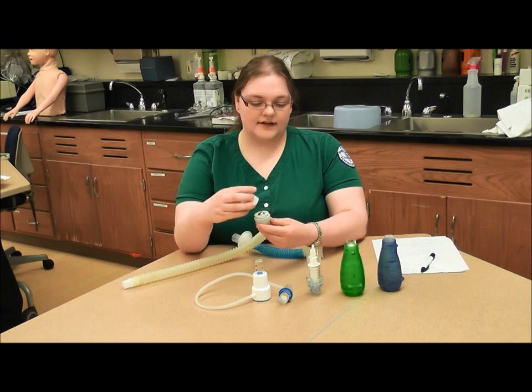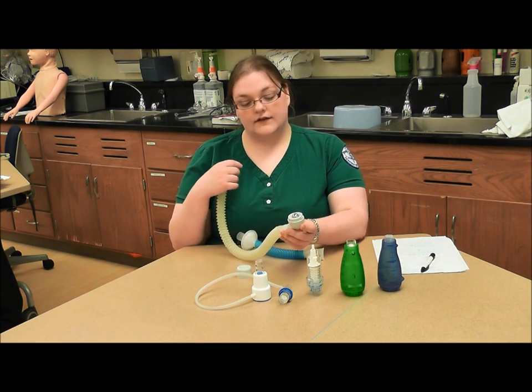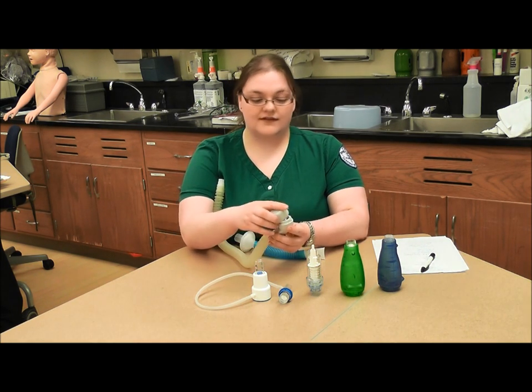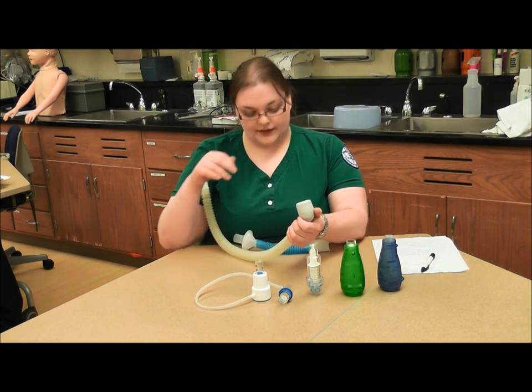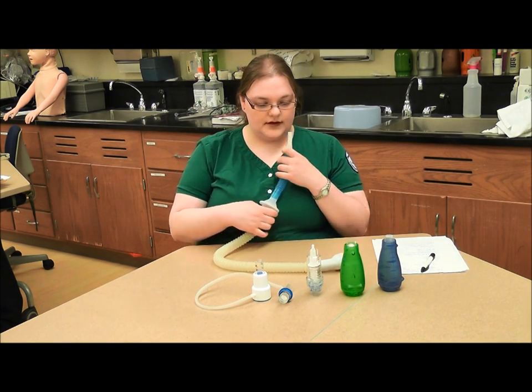You put it back together, and when the patient breathes into this, the object is to exert enough force to lift this ball bearing out of its seat and have it flutter and cause different back pressures against their breathing. I'll give you a demonstration.